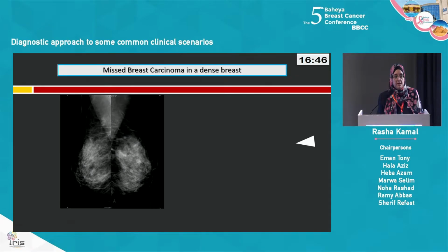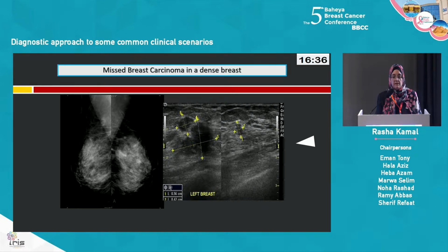And I will show you one example which shows really how mammography can be deficient. This was a young female. She had a heterogeneous dense breast parenchyma, and in spite of the fact that on the ultrasound we see a multicentric carcinoma, we can hardly detect this carcinoma on the mammogram. We might suspect some areas, but we will never be sure without a complementary ultrasound.